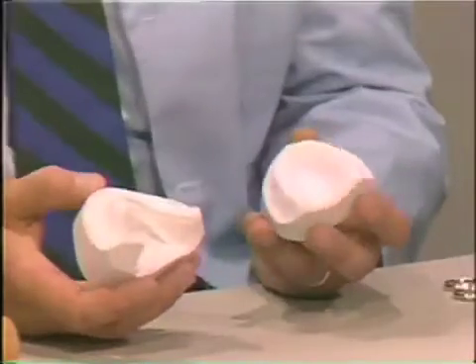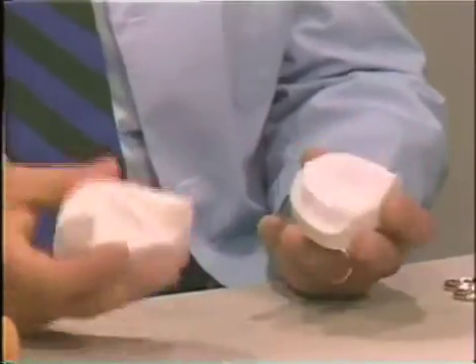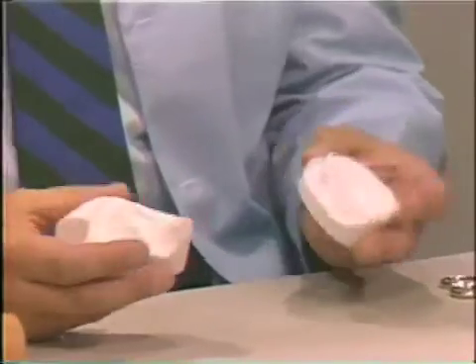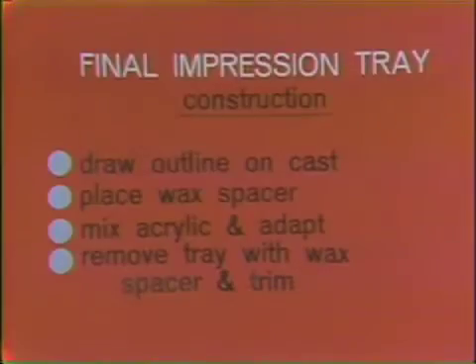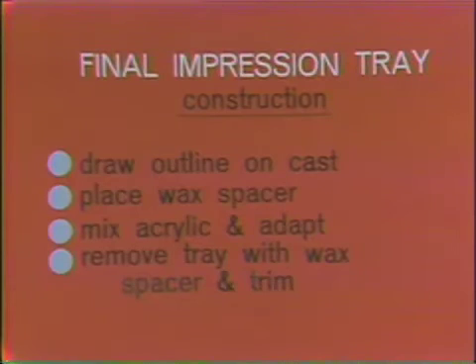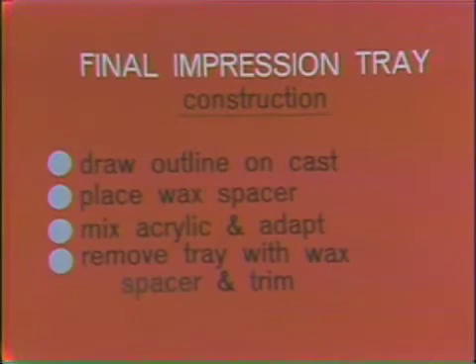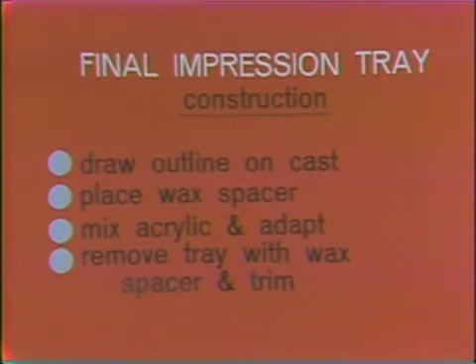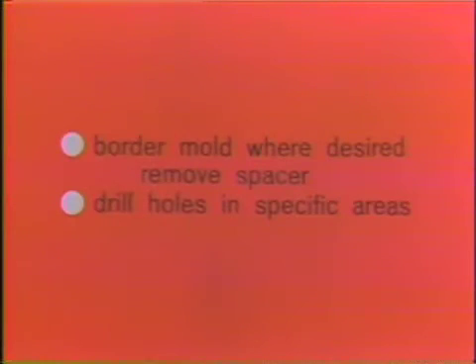With these, I will proceed to create the final impression tray. Before we do this, I'd like to go through the sequence of events which we will follow. We will start by drawing the outline of the final impression tray on the cast. Then a wax spacer will be placed with 28-gauge green wax. Then we will mix a cold cure acrylic and adapt this to our preliminary cast. And then we will retrieve the tray with the wax spacer and trim. Following this, we will go back to the mouth and border mold the final impression trays where we desire to do so.